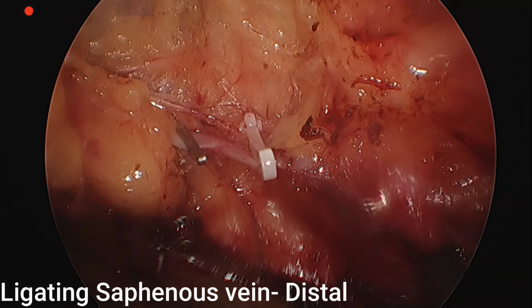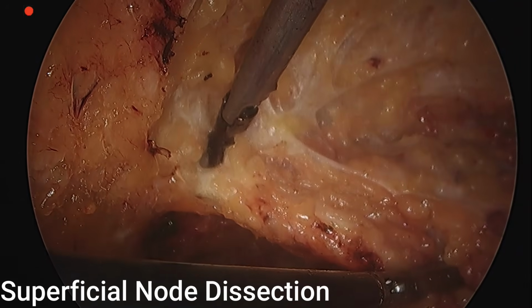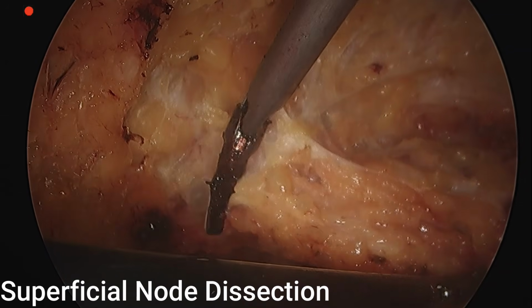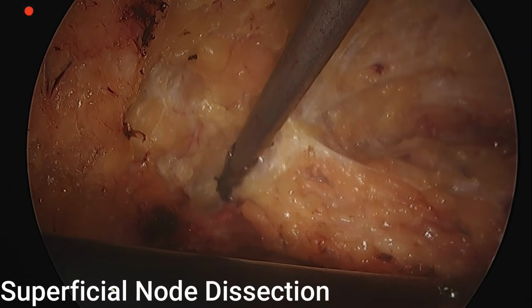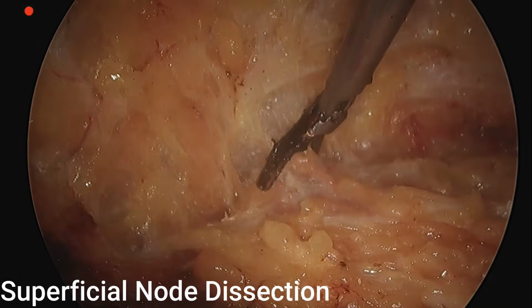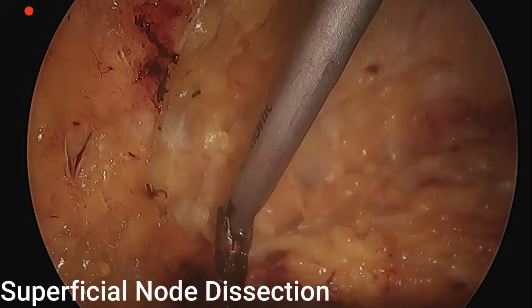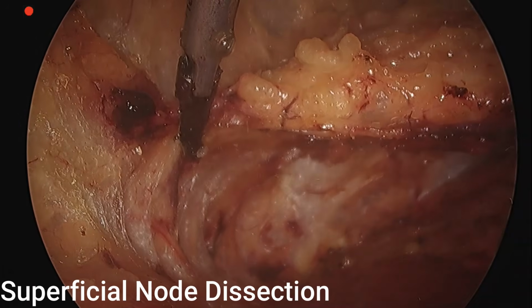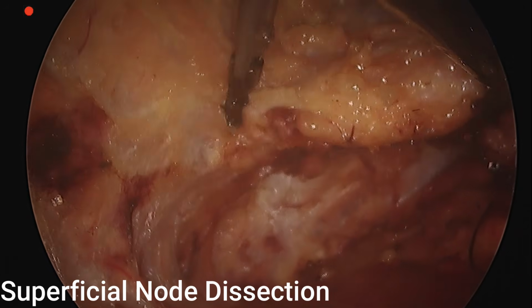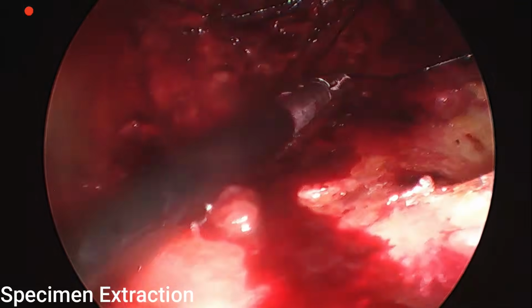Now we ligate the saphenous vein distally and release the superficial nodes from the Scarpa's fascia. You can see the glistening layer of the Scarpa's fascia since we have already separated the entire superficial system from the deep system. The only thing we have to separate is the Scarpa's fascia to remove the superficial nodes. There will be a few tributaries of the saphenous vein, that is the superficial epigastric, superficial circumflex iliac, and superficial external pudendal, which can be managed by the ultrasonic shears to remove these nodes. As you can see, the superficial system is completely separate from the deep system.